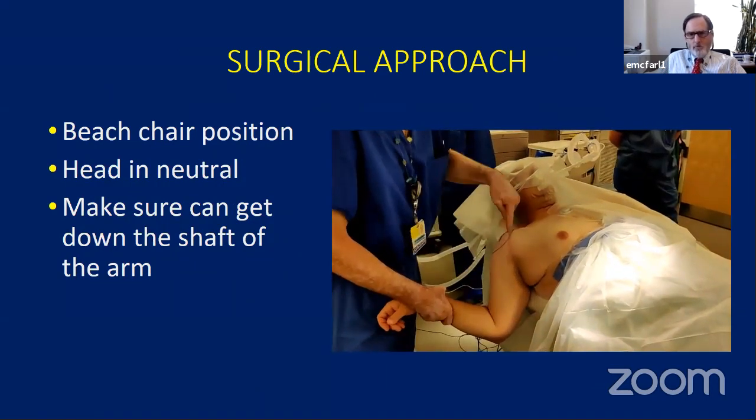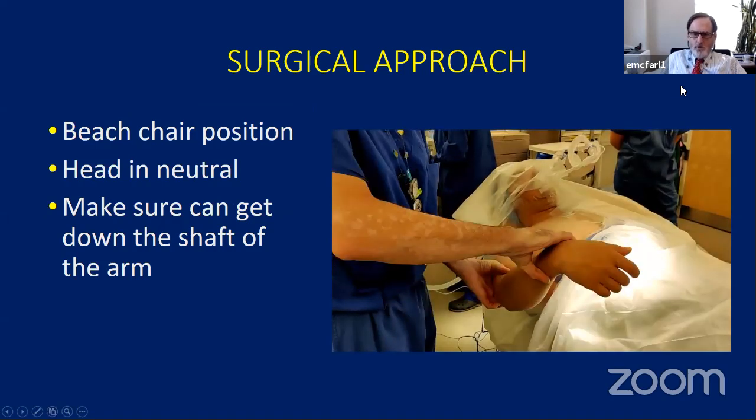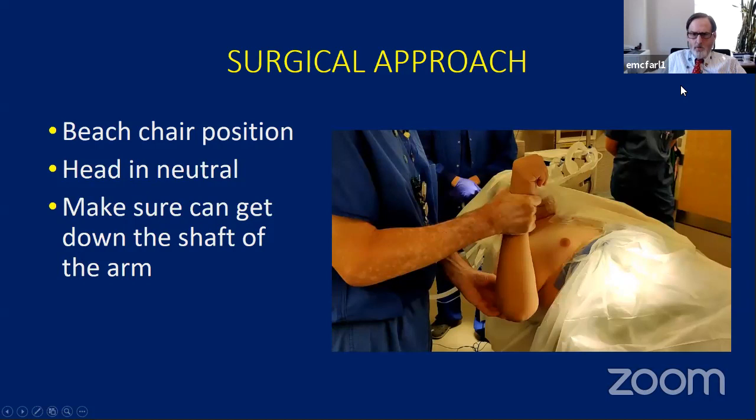So the whole thing starts with positioning the patient. We use a sort of modified beach chair without a headrest, and we just bring the patient to the side of the table.